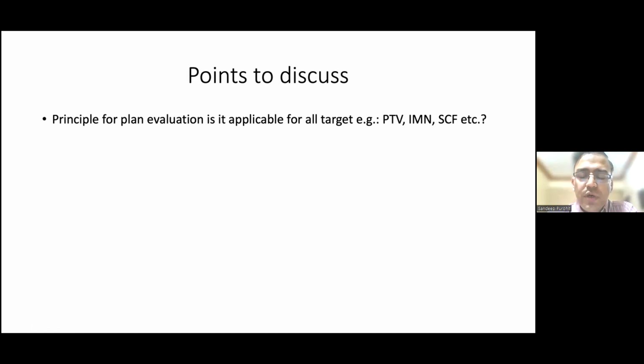And technically, it also takes more time for the patient to get treated with IMRT. So in terms of dose to the contralateral breast and the treatment time, we usually go for field in field without DIBH. And if in field in field, the D mean of heart is not achievable, then we go for IMRT.